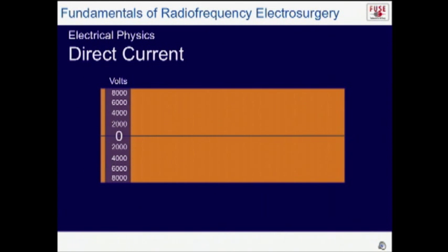Now, let's talk about currents for a second. If we make a direct current, like the one that you used with your toothbrush or your flashlight in the last 24 hours, what happens is ions or electrons flow from one pole to another. So the polarity is fixed. If you looked at it on an oscilloscope, you would see this.